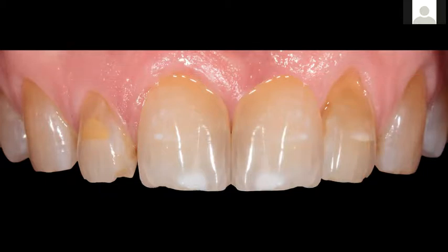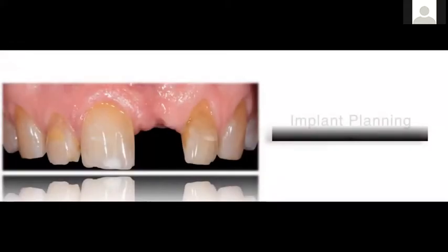So here, when we move forward, the other aspect that we need to look at with the implant planning is that we want our implant basically to be about 3 millimeters below that facial gingival margin. And you'll see during the surgical procedure how we go about checking that and making sure that we indeed end up with the implant being 3 millimeters below the desired gingival margin, not what the gingival margin is right now. So if you can look, the gingival margin right now may be right here, but this is where we want to be, 3 millimeters basically apical to that, as you can see here in this kind of animation.